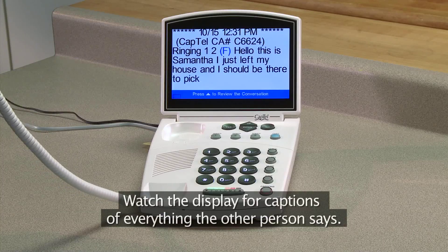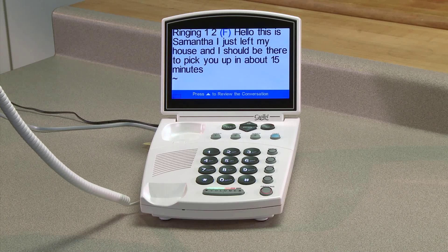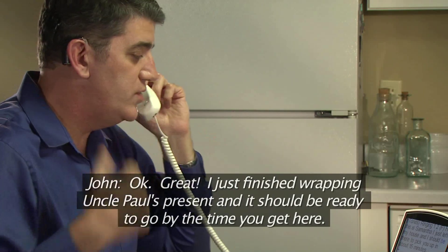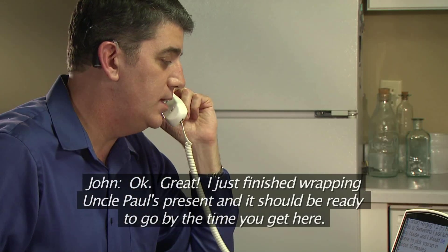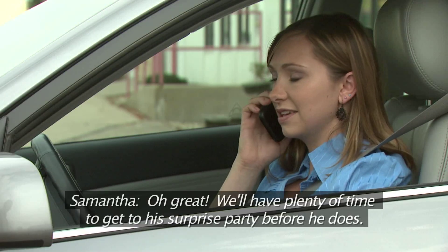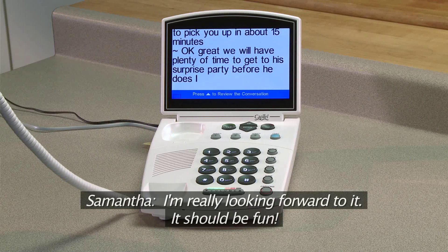Watch the display for captions of everything the other person says. Okay, great. I just finished wrapping Uncle Paul's present and it should be ready to go by the time you get here. Oh, great. We'll have plenty of time to get to the surprise party before he does. I'm really looking forward to it. It should be fun.